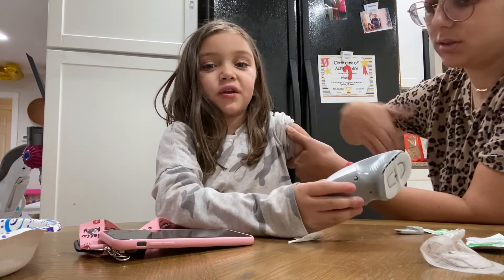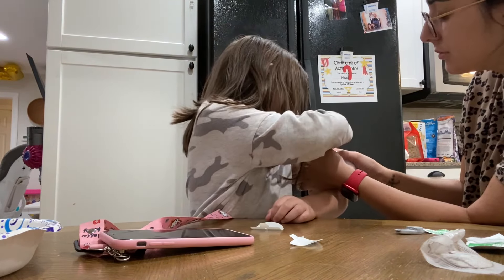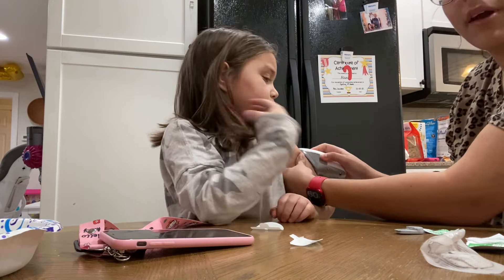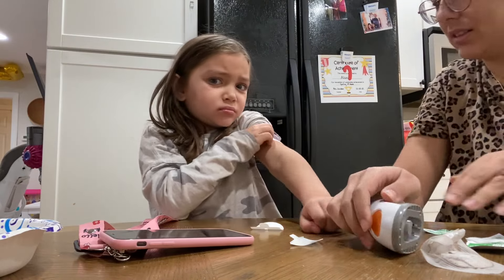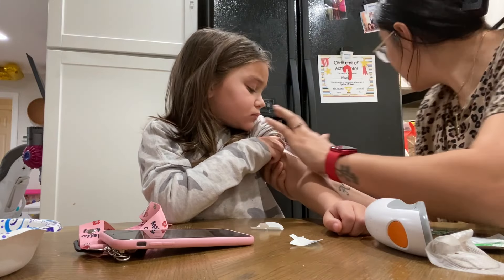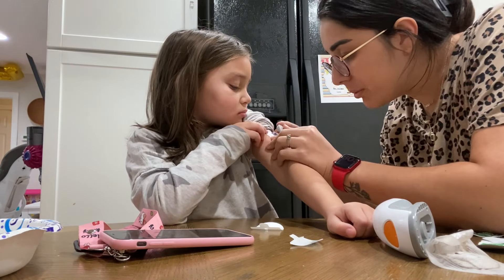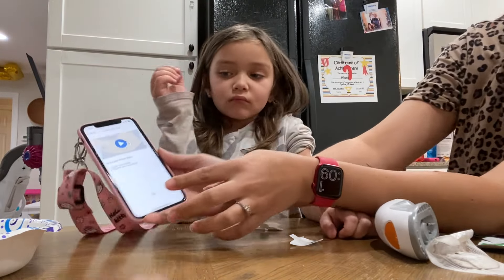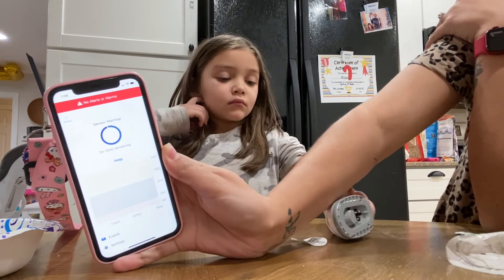Hold it. No bleeding — no bleeding for your transmitter — maybe a little bit of bleeding. There we go. Want to press start? All right, go ahead, press start. And sensor is warming up.